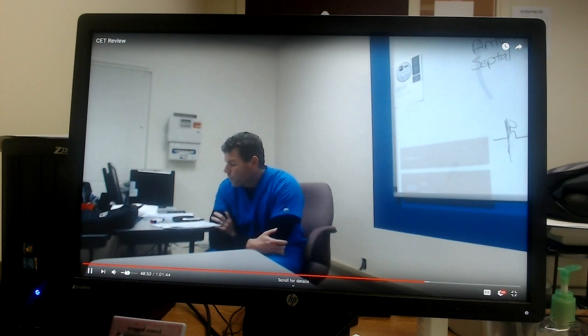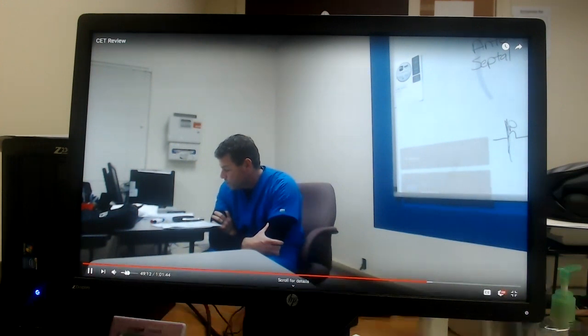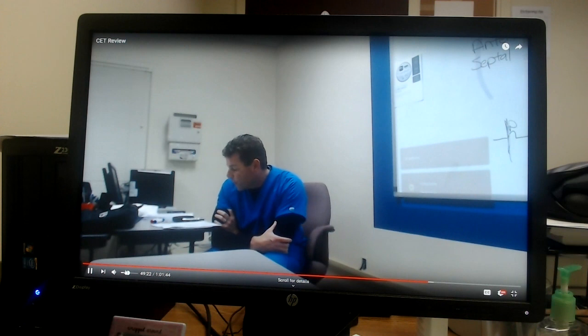91. Which of the following portions of the EKG reading is created by an electrode that is placed on the fourth intercostal space to the left of the sternal border? V2. Okay, good. The technician is performing an EKG on a patient who is experiencing atrial fibrillation. In order to calculate the patient's heart rate, which of the following methods should the technician use? 6 seconds, good call. Which of the following describes a positive deflection that occasionally happens prior to the P wave?